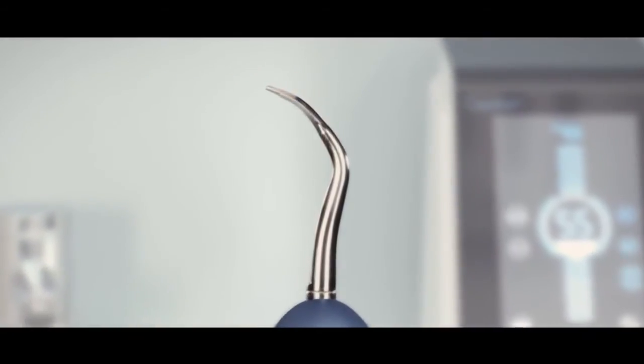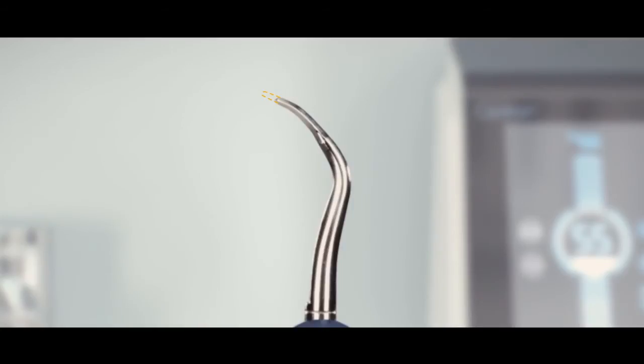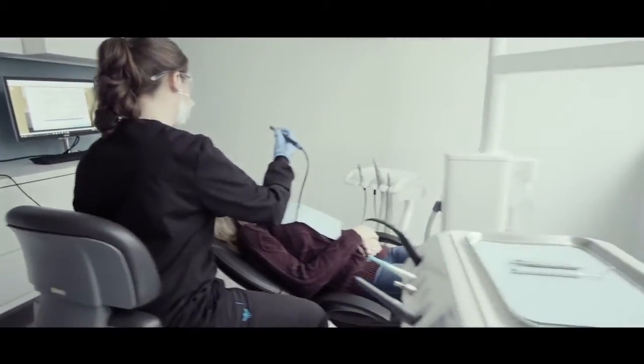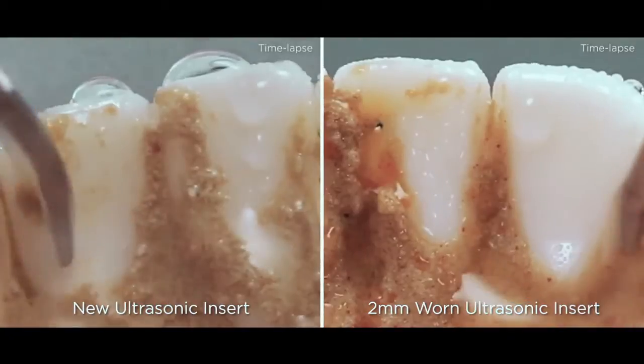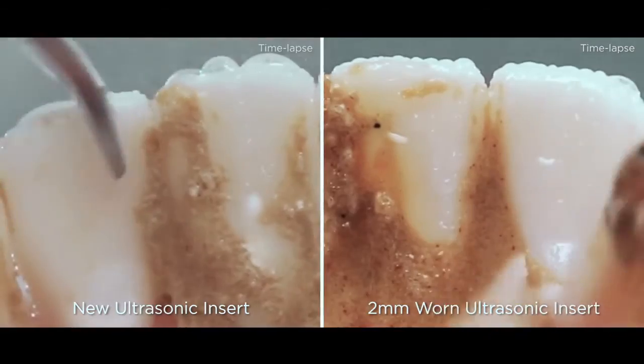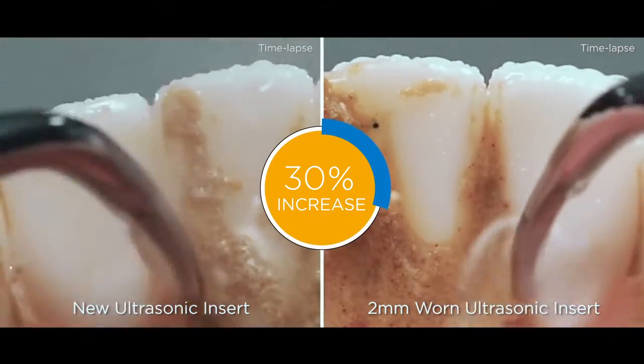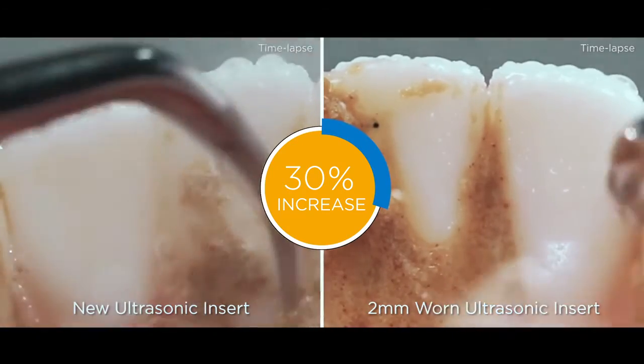As the tip wears from use over time, this lost length translates into a loss of efficiency. In this test, we compared a new Cavitron ultrasonic insert to a Cavitron ultrasonic insert with only 2 millimeters of wear. On average, the worn insert results in a 30% increase in total scaling time.